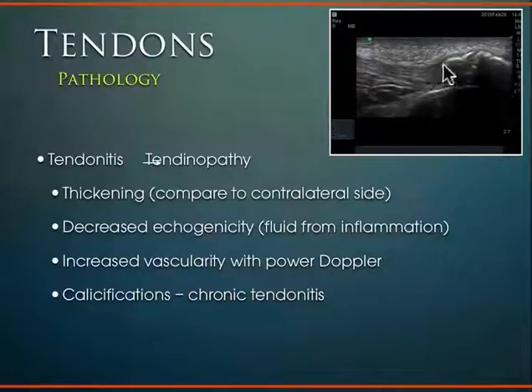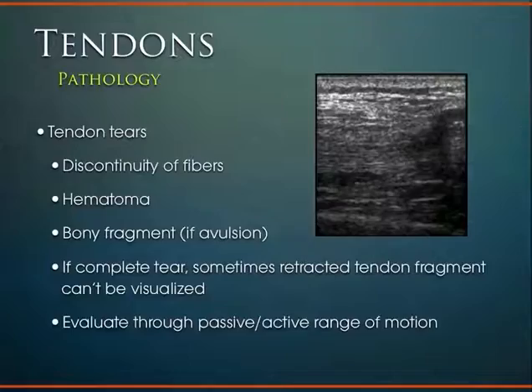And just like bone, the calcific changes that you can see on this image here tend to be very thick, hyperechoic structures. So these are calcific changes within the tendon architecture through here. And just like bone, you're going to get a lot of deep shadowing below that very hyperechoic thick tissue because the sound waves don't penetrate through. So you see nice normal tendon tissue coming across, and you see this calcific change. So a nice example of some of the pathology that you can see.